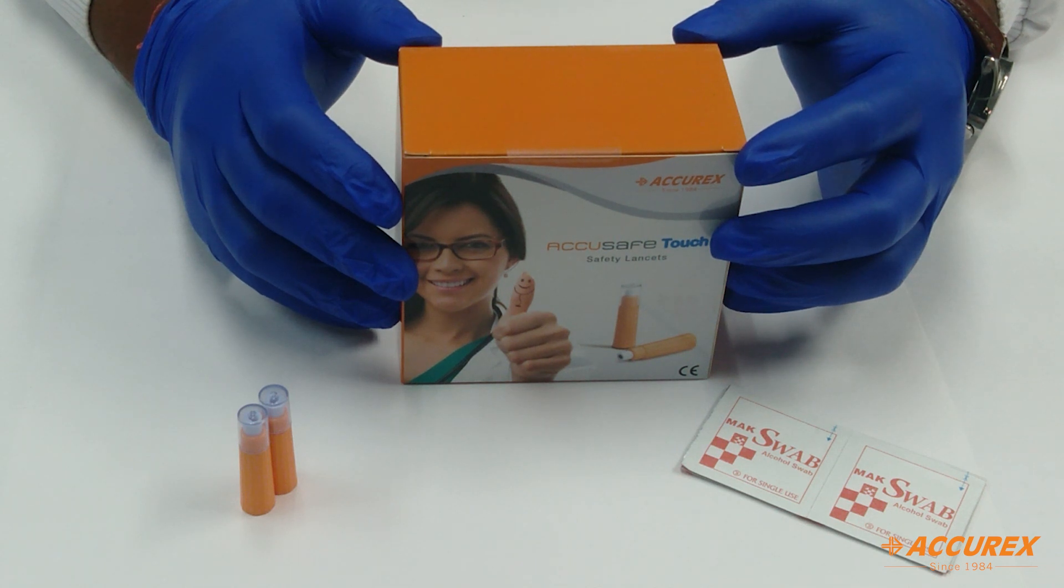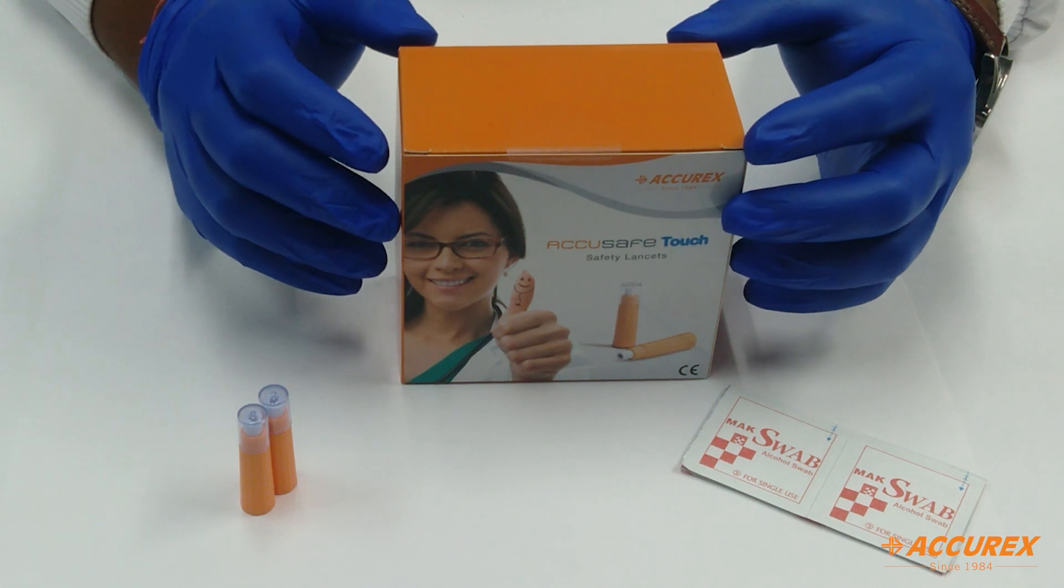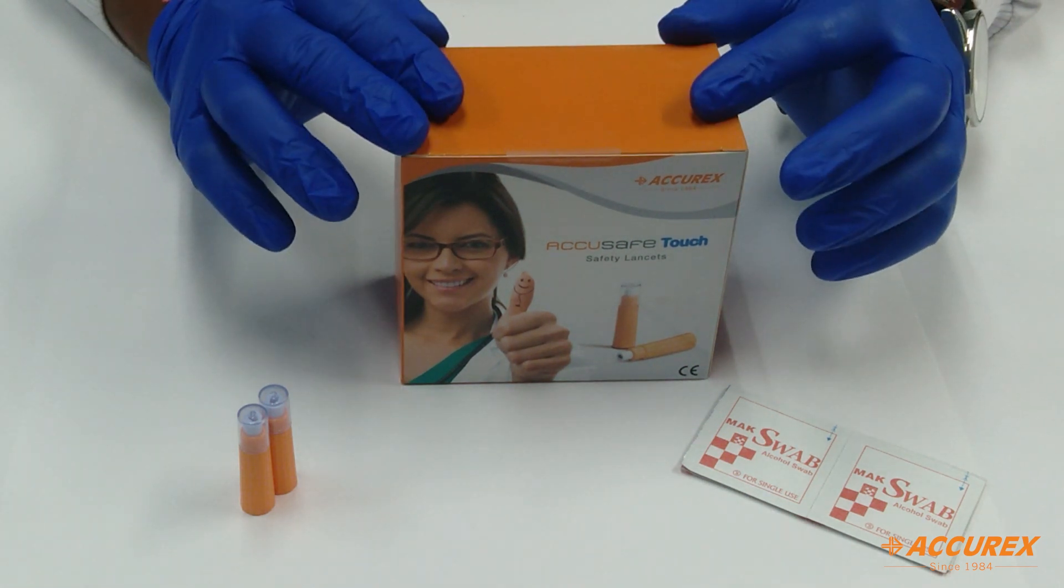You can say glucose, HB1C or uric acid testing, wherever the small pricking is done. This lancet is useful for the same.